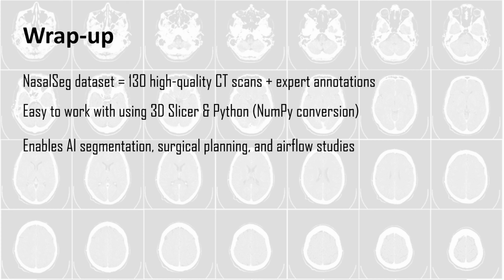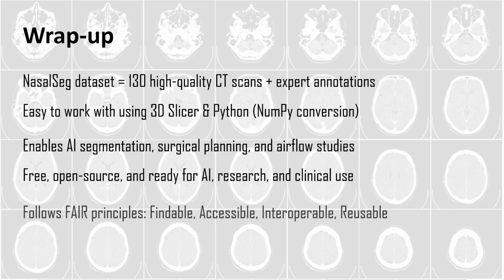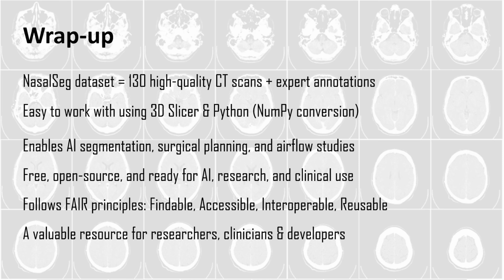What makes it even better is that it's totally free and open source, following the FAIR principles. That means it's easy to find, simple to use, and licensed for anyone to work with, whether you're a researcher, clinician, or developer. I personally think datasets like this are exciting because they're not just locked away for big companies. Anyone can access and use them to help improve healthcare. So if you're interested in medical imaging or AI, I really recommend checking out the NasalSeg Dataset for yourself.